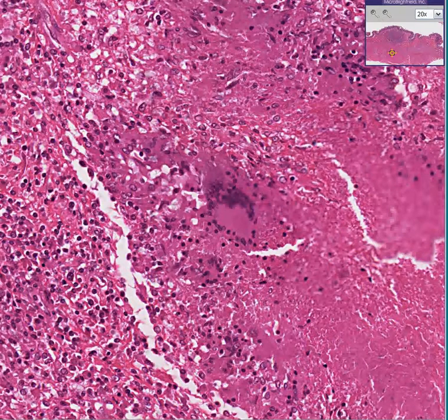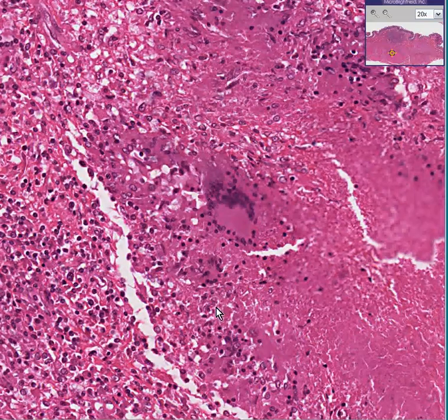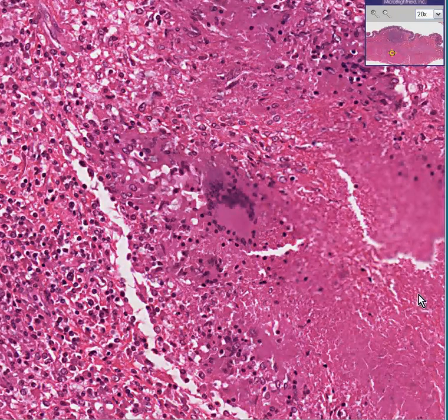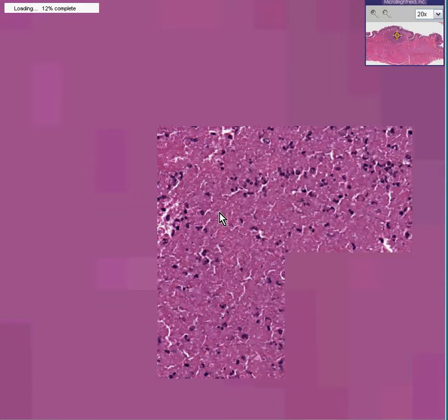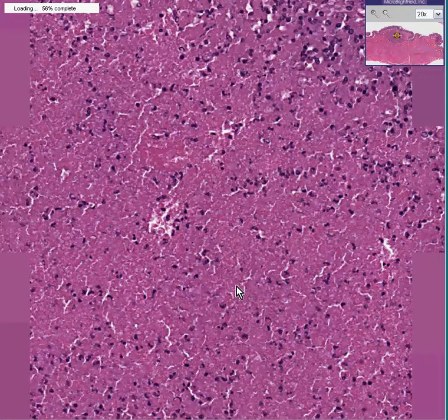Similarly, if you were to do a Ziehl-Neelsen or acid-fast stain in this area, there's a good chance you'd find red bugs within these histiocytes or perhaps even in the necrotic areas, representing acid-fast bacilli. This is a really good picture of necrosis because it's granular and you don't see cellular detail. Here's another nice picture of necrosis inside another one of those nodules — you can see neutrophils and granular debris.